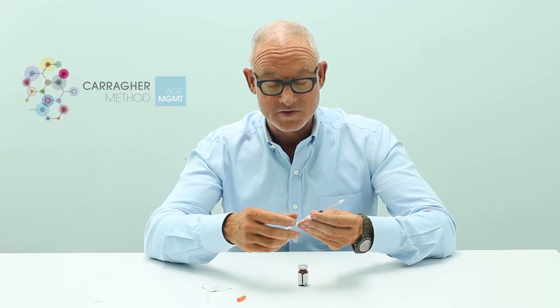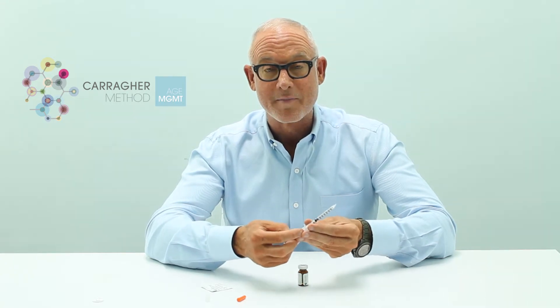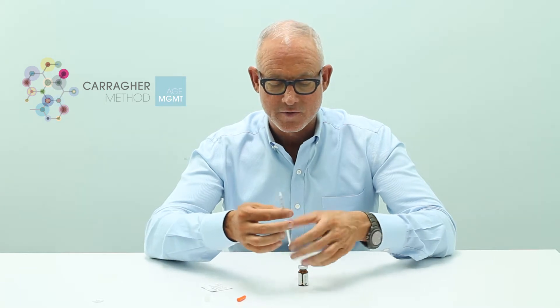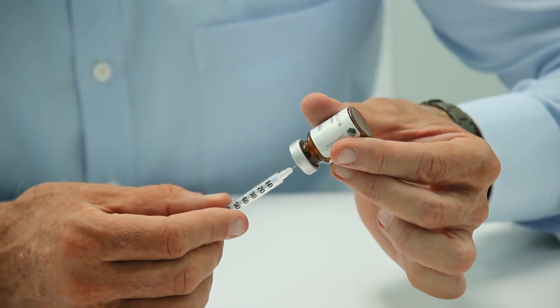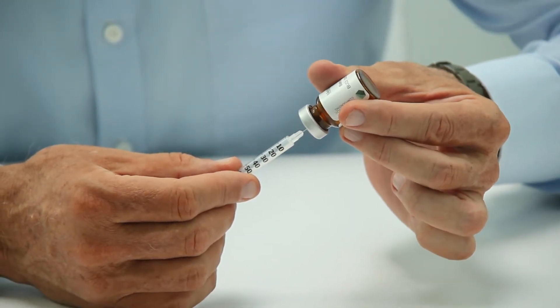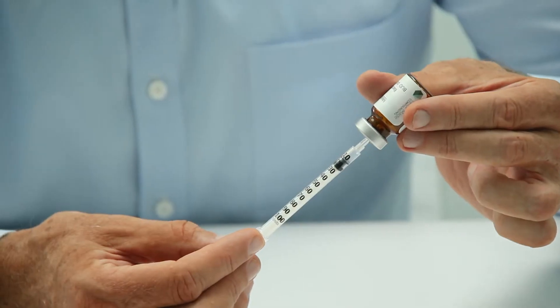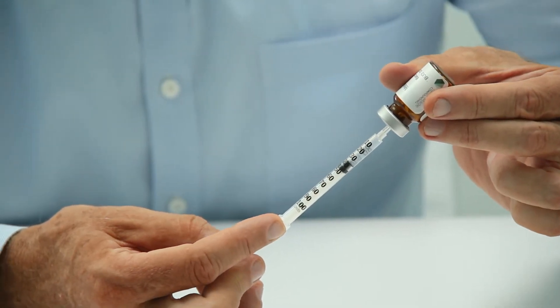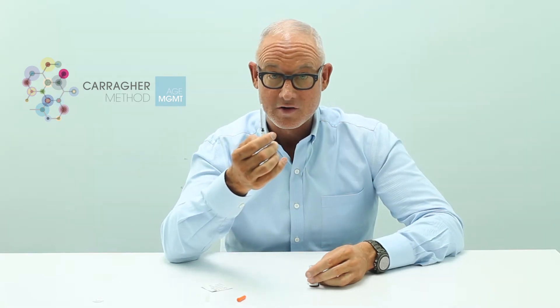For this medication, the dosage is to inject 0.7 mls. What I like to do is draw that much air into the syringe first, then at a 90 degree angle put the needle tip into the medication and inject that air in — it creates a little bit of a vacuum and makes drawing the medication out much easier. See how easily that comes out. We're going to go up to the seven mark, which is 0.7 mls. Hold that out and now we're ready to inject our medication.